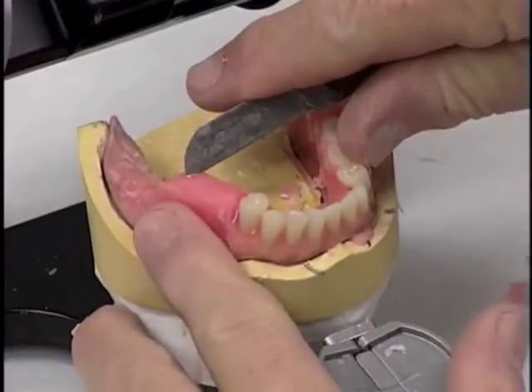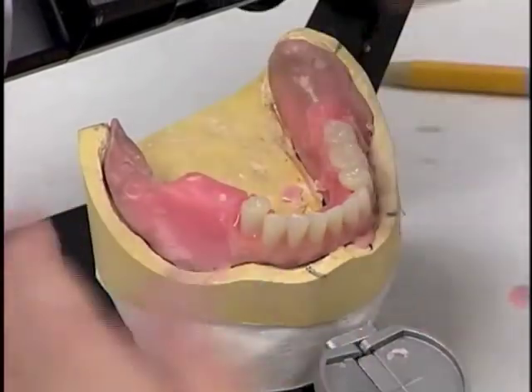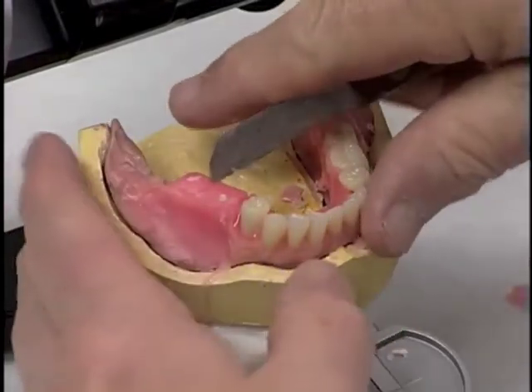And now we're ready to remove wax from the molar area where we're going to place the first molar.